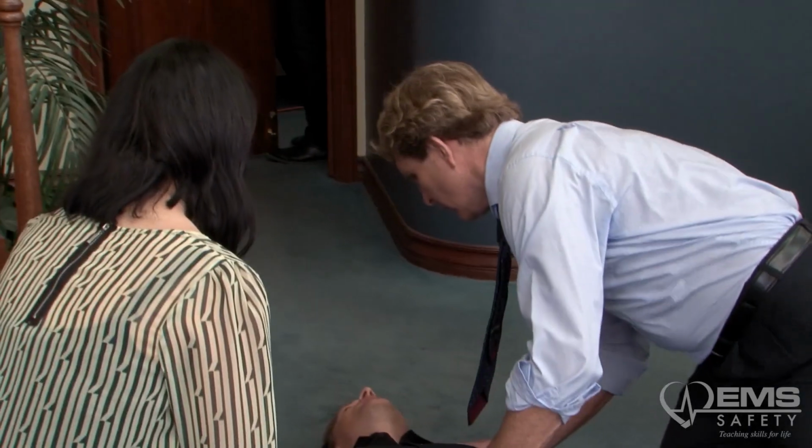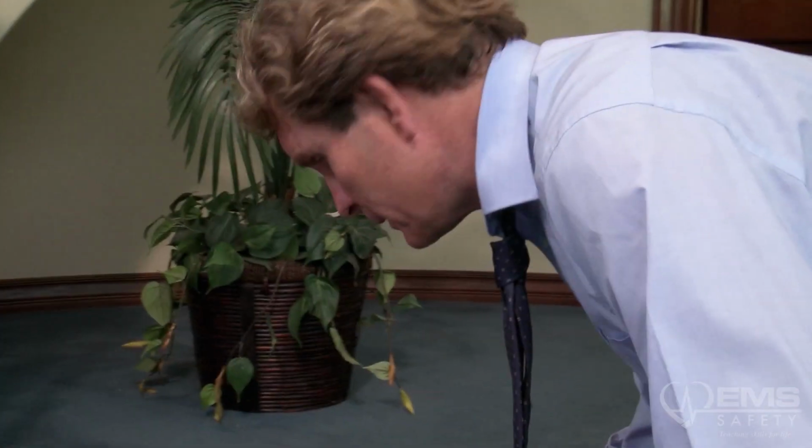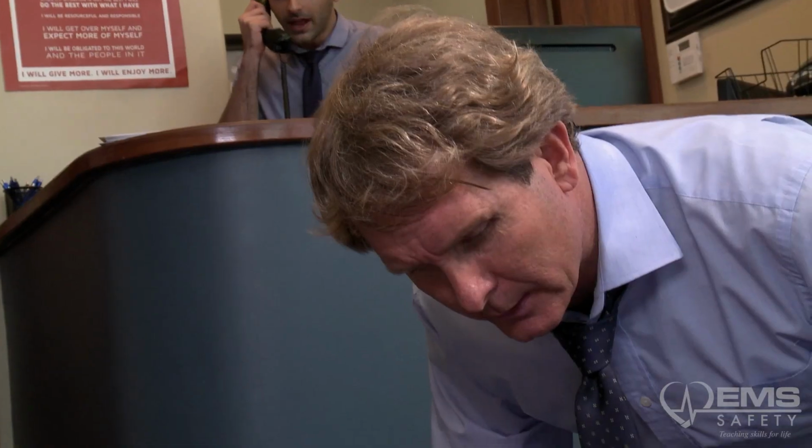Are you okay? What's wrong? Is he okay? What happened? Are you okay? Call 911. Go get the AED. He's not breathing.